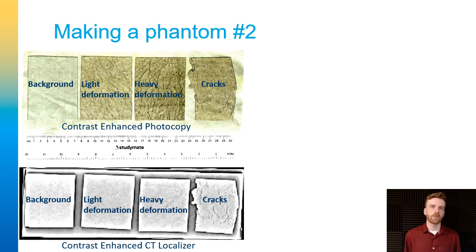I even went one step further and included lengths of the outer lining and the inner lining in case they contributed to degradation in the image at all.